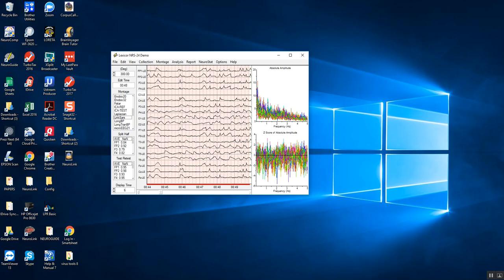with more advances and an implementation of this into neurofeedback, which will be unique. Nobody's done cross-frequency neurofeedback. Nobody yet has been able to analyze in as much detail the cross-frequency nature of the human brain, and to have normative data all the way from birth to 82 years of age, where you can see how this cross-frequency dynamic matures and how there are growth spurts and there are changes at different ages. And that's why a normative database is so important, because it age matches your patient to a reference group, since the brain maturates and changes from birth to adulthood.